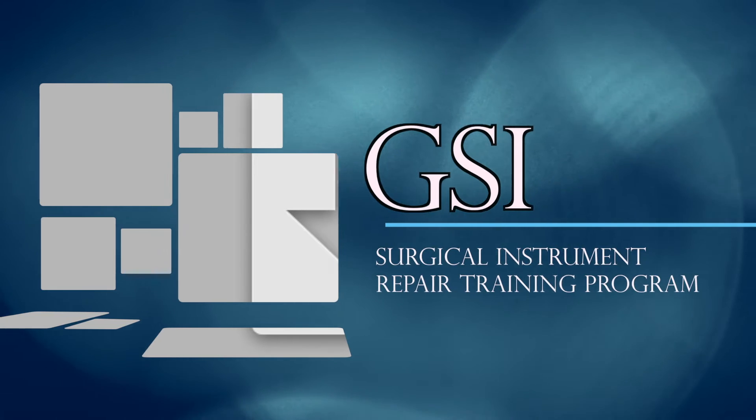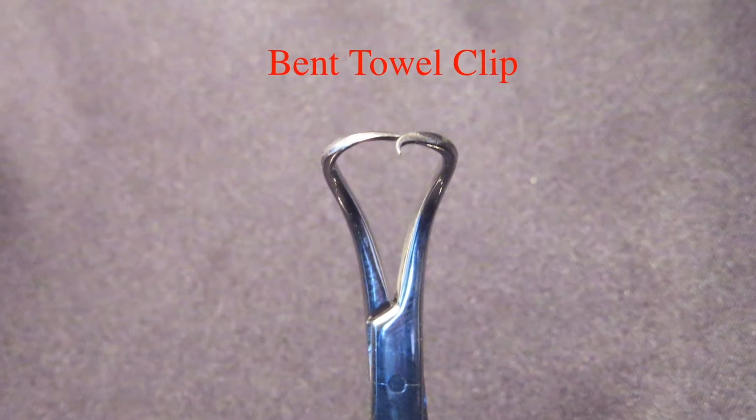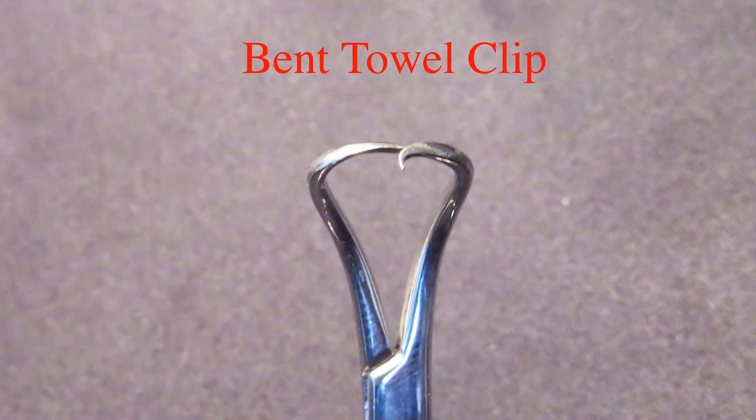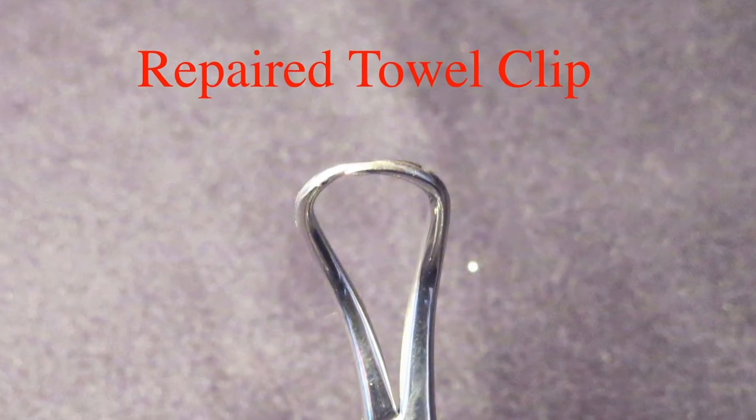Welcome to GSI's Surgical Instrument Repair Training Program. This program is designed to equip you with the knowledge and skills to perform basic adjustments to ring handle forceps, tissue forceps, skin hooks, and small rake retractors.